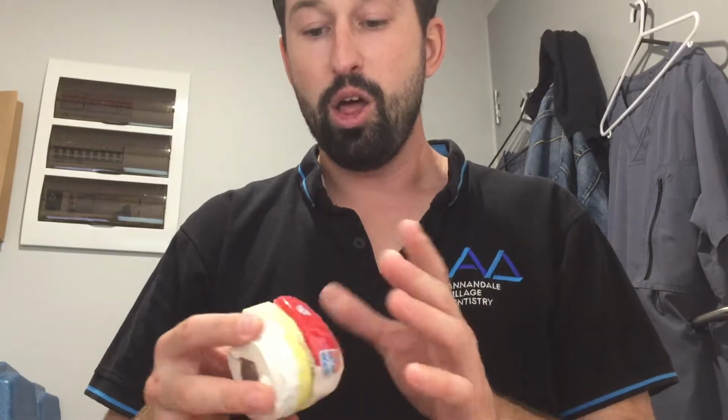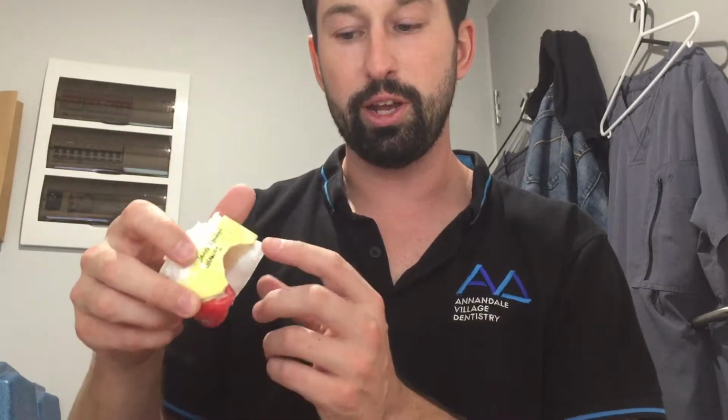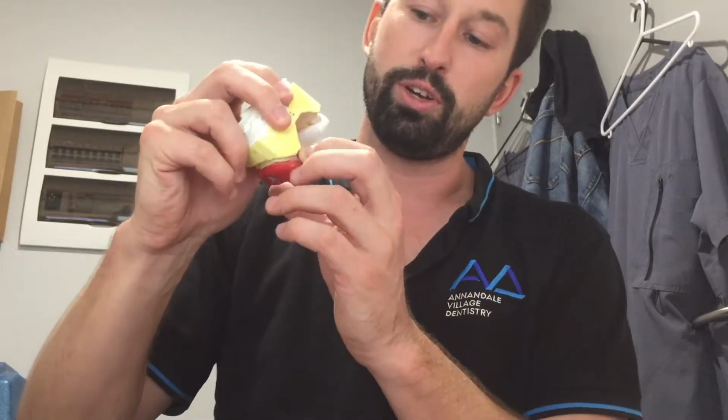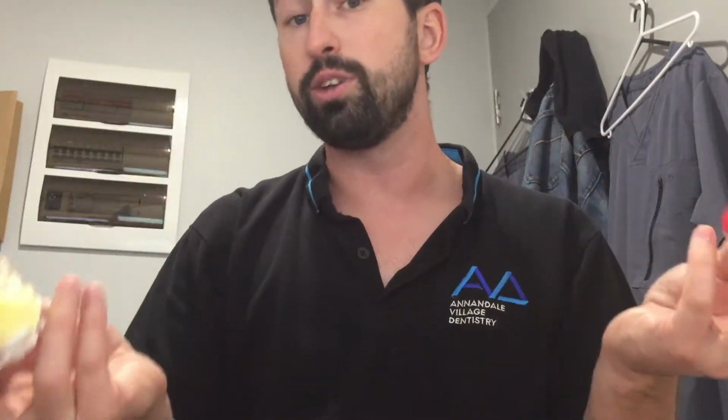Yes, it is. The way that these work is they're either vacuum or pressure formed to the cast, to the model of your teeth. And so they have incredible suction and retention, and it's hard for air or liquid to get in between here and down against your teeth. But if you consciously think, all right, I want my mouthguard out, I'm going to put my tongue in the back here and just lift down here. I've let air and liquid get through here. I've broken the suction. If I do that on both sides here, now this mouthguard comes out quite easily. It's not difficult to get it out then.